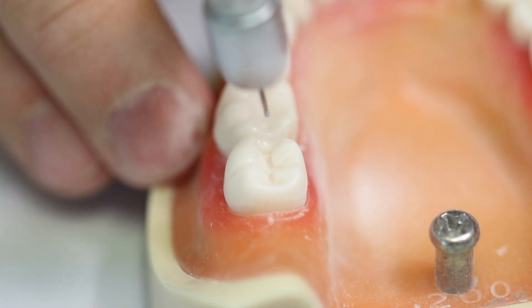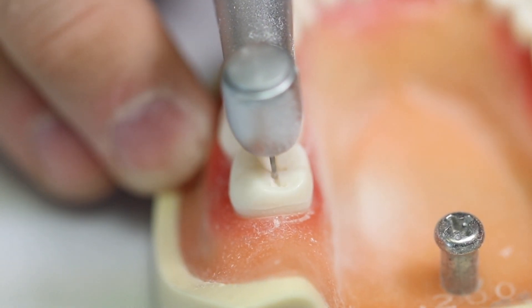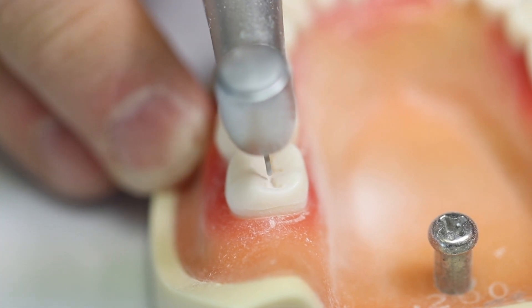Follow the anatomy of the tooth into the distal pit and mesial pit, rounding the cusps and deepening the preparation.